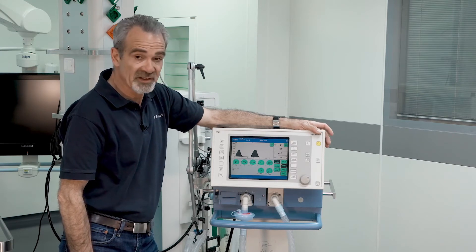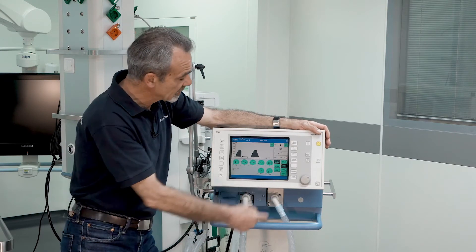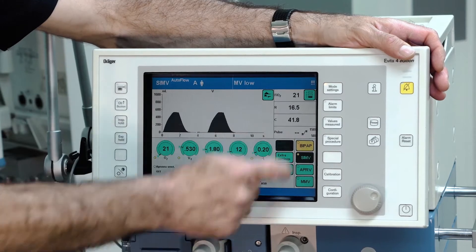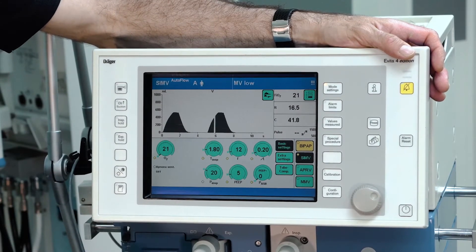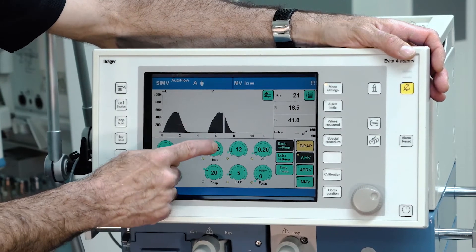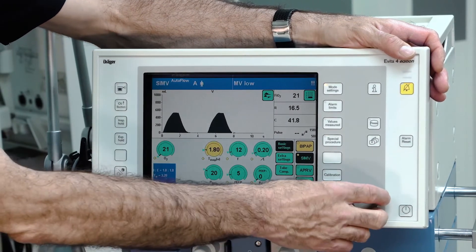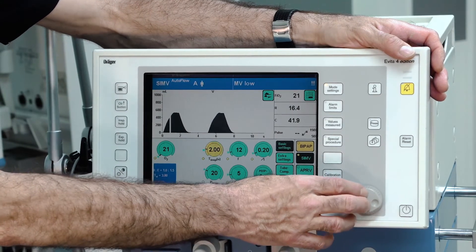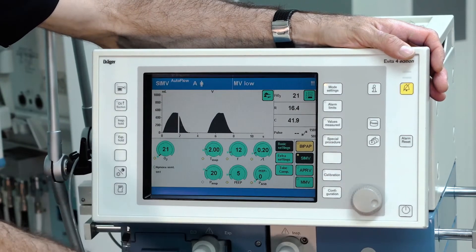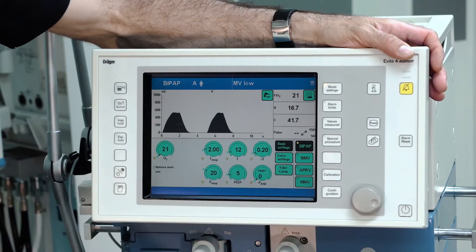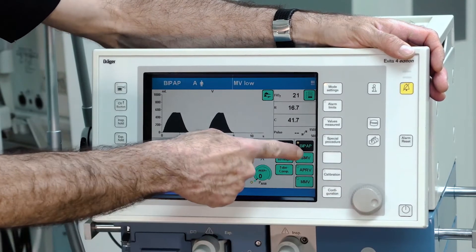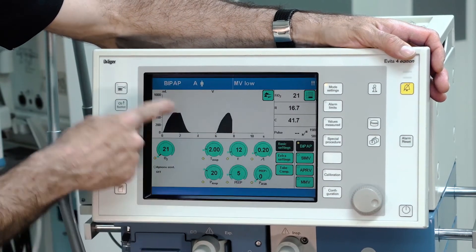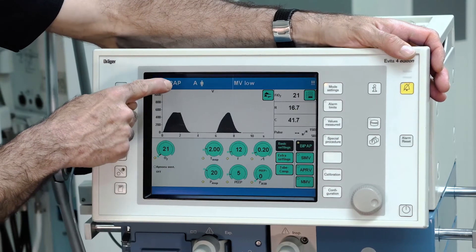To change the ventilation mode in general, select your desired ventilation mode, adjust your settings using the rotary knob, and confirm. In this example, we changed the ventilation mode from SIMV to BiPAP.